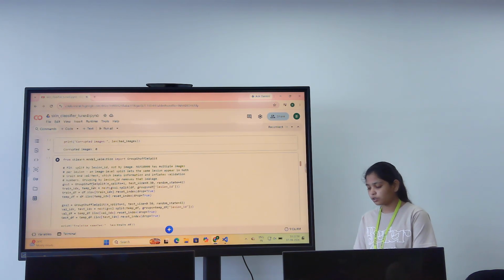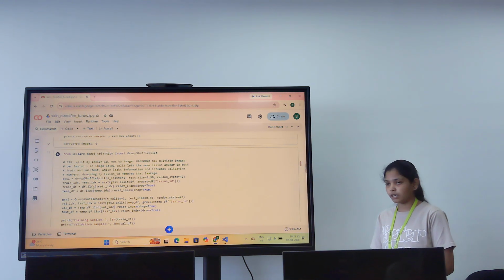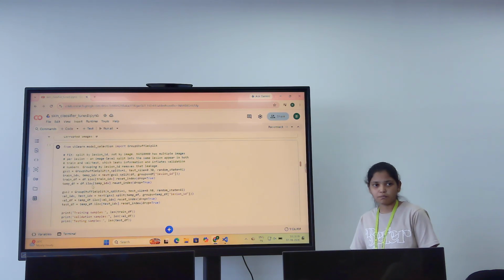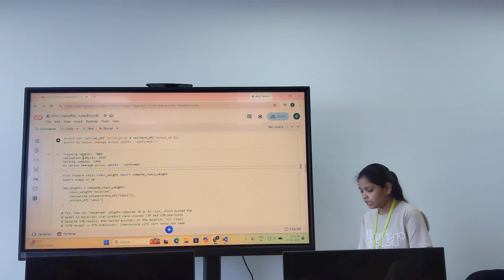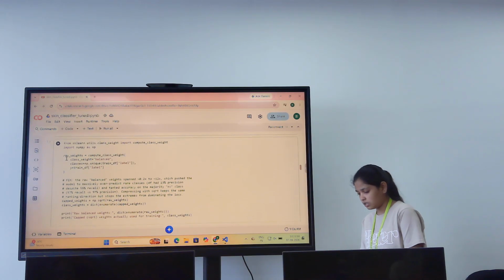To split the dataset, I use group shuffle split because the Kaggle dataset contains multiple images of the same lesion. If the same image appears in both the training and testing datasets, it gives an artificial performance improvement. So I ensure that no lesion appears across the splits. Here we can see the training samples, validation samples, and testing samples, and I also confirmed that no lesion leakage across the splits.